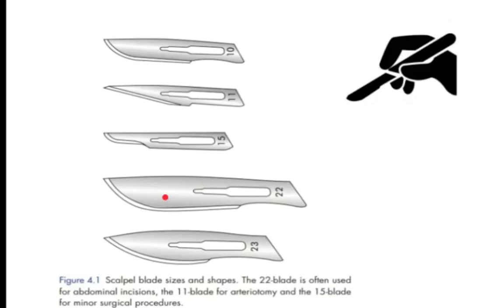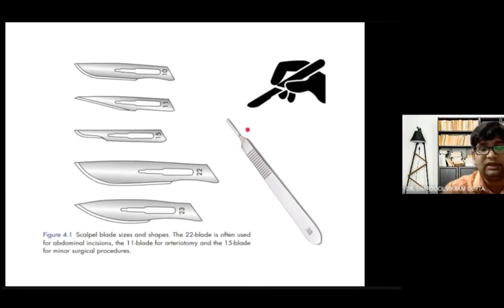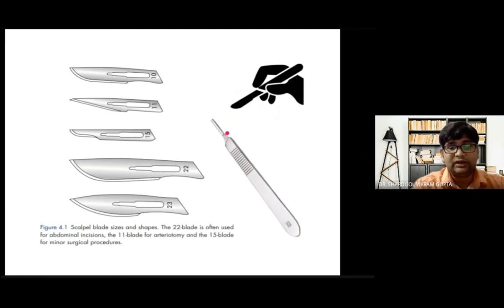The blade should never be held by hand directly — it should be incorporated into the BP handle. There are grooves on the handle to incorporate the blade. Once the blade and BP handle are assembled, you can proceed to make the incision.